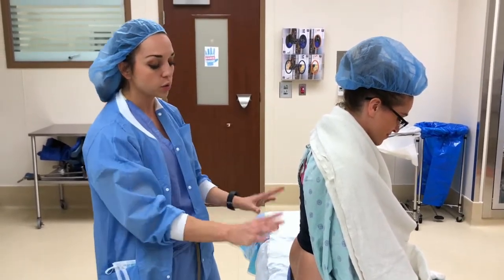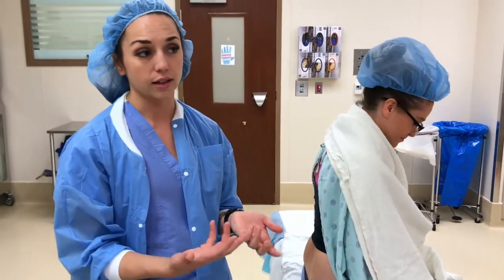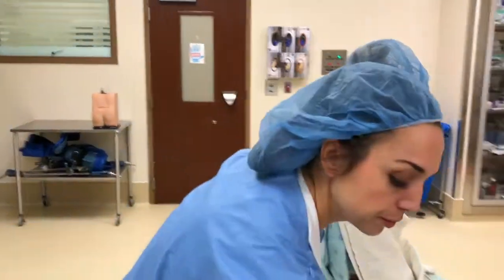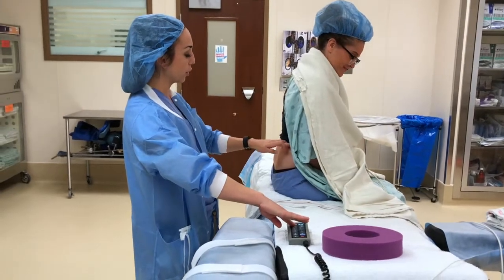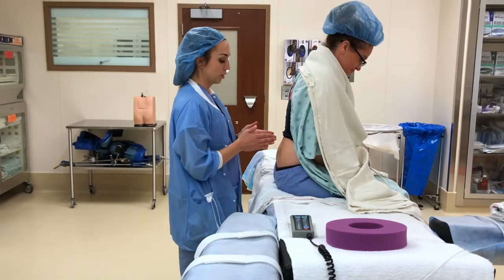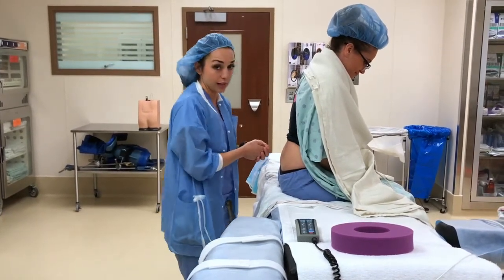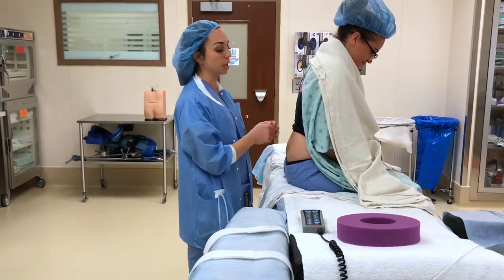So once you have found adequate positioning, before I get gloved back up, I will typically adjust the height of my bed. You take your remote, and I probably lift it up to about where L3, L4, L5 will be, so that I don't have to slouch over or scrunch down. Not too high, not too low, just a comfortable pushing height.